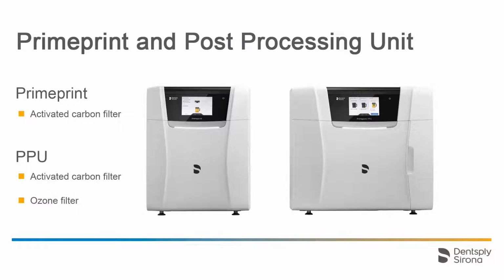The filters in the Primeprint and post-processing unit must be replaced or cleaned regularly. You will find an activated carbon filter in both the Primeprint and the post-processing unit. The activated carbon filter is changed by your service technician as part of the annual maintenance.